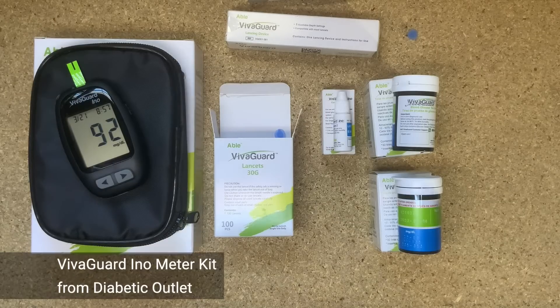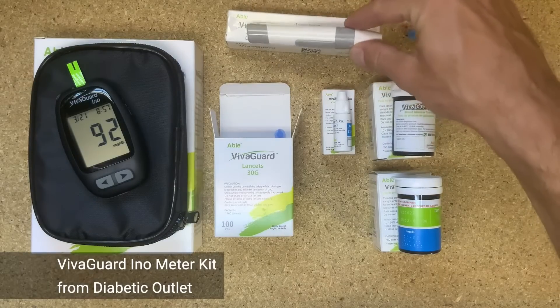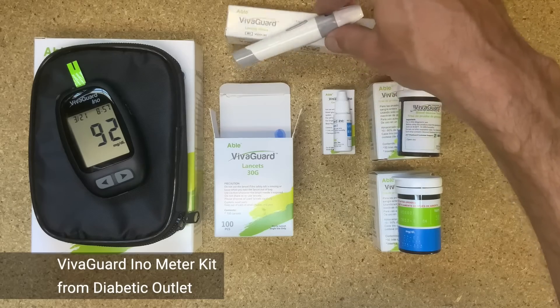One little feature that's nice about this blood glucose meter and lancing device is that they have little eject buttons on them.